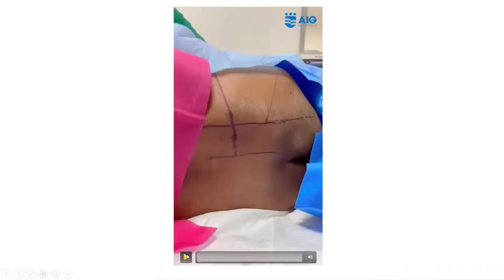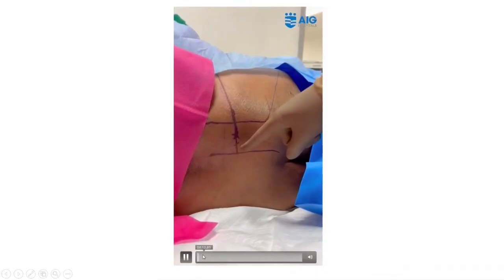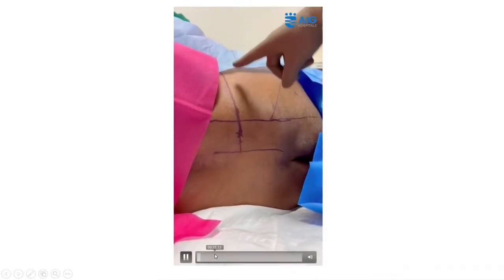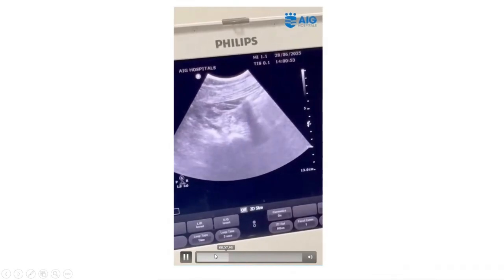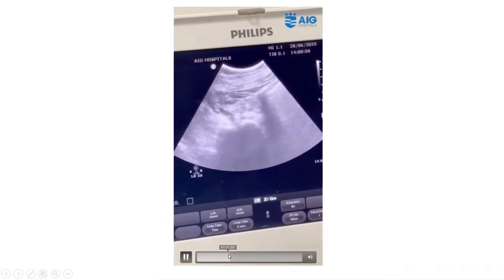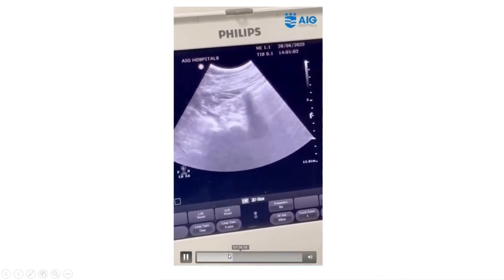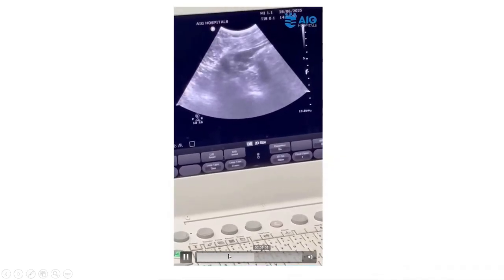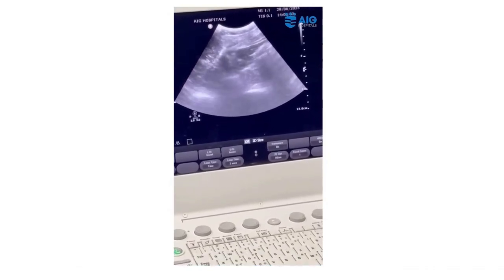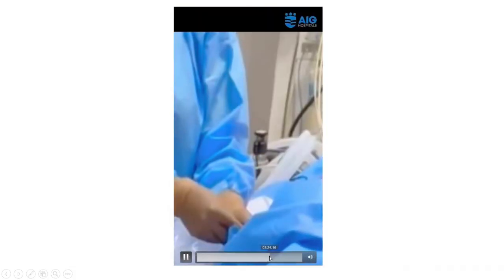To return to the case we started with, we performed a lumbar and sacral plexus block. The method we used for lumbar plexus block was the shamrock method. Upon eliciting quadriceps twitches, we proceeded to inject 20 ml of 0.2% ropivacaine. For the sciatic sacral plexus block, we used Mansour's parasacral approach, PNS guided. And upon eliciting dorsiflexion, we proceeded to give the injection.